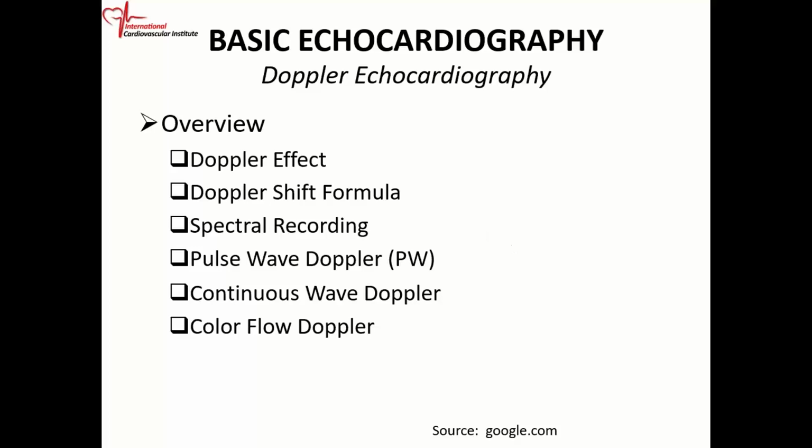You will realize immediately that in order for you to do any type of calculation, say you want to look at a gradient, you want to look at the valve area, that involves Doppler.